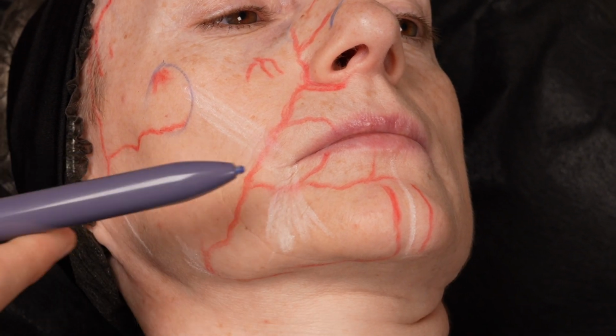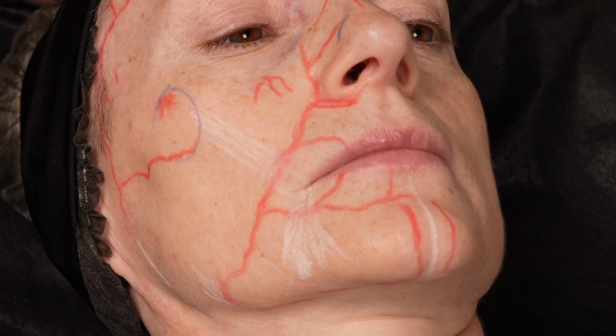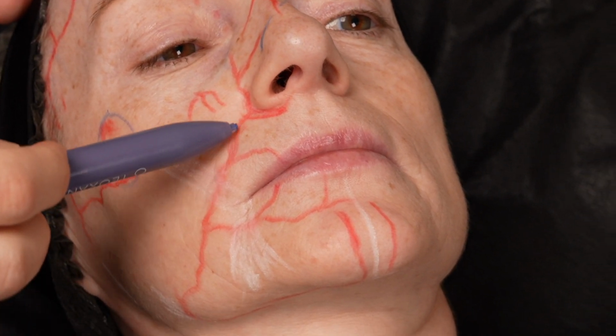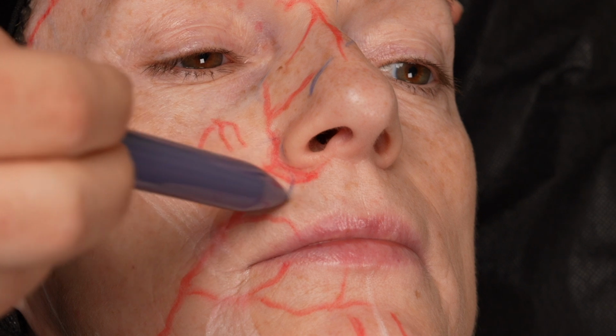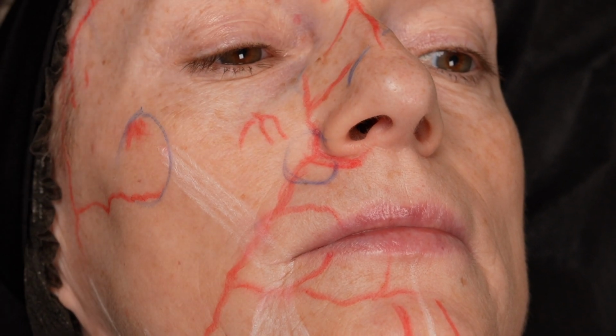It's still deep. Zygomaticus major muscle, my second branch still goes underneath the zygomaticus major and comes up and also superficial. It means around here my facial artery is coming more superficially.